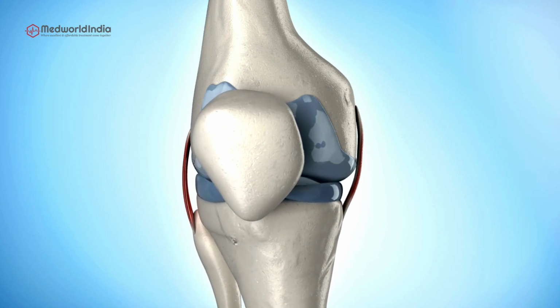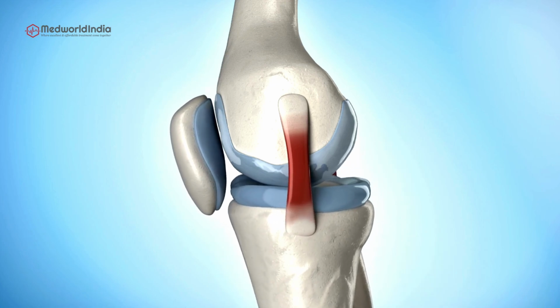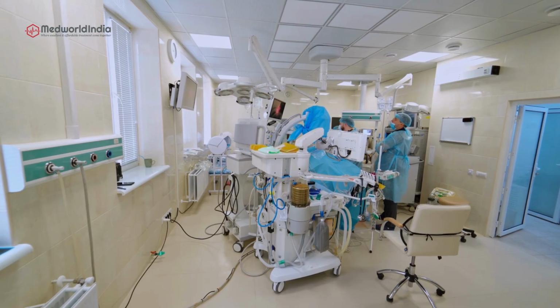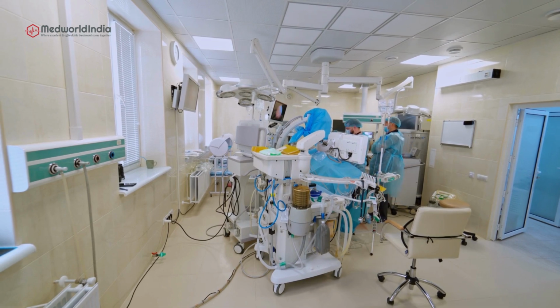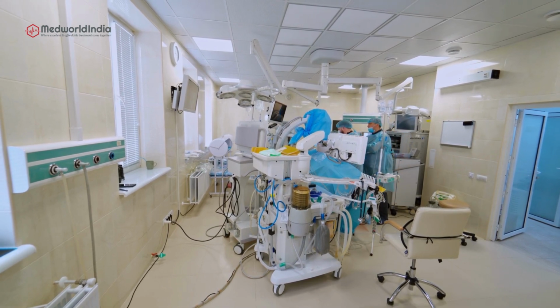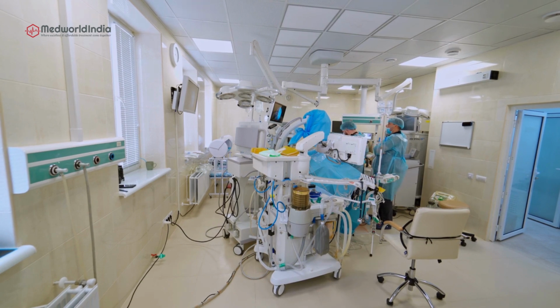1. Knee arthroscopy. A minimally invasive procedure where a small camera, arthroscope, and surgical instruments are inserted through small incisions to visualize and repair the joint. May be used to remove damaged tissue, smooth cartilage, or repair meniscal tears. Not typically used for advanced arthritis but can be helpful for addressing accompanying issues like meniscal tears.